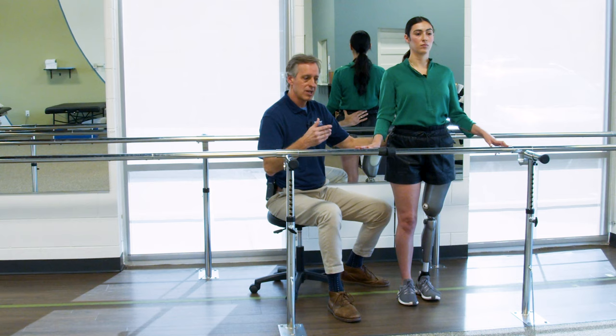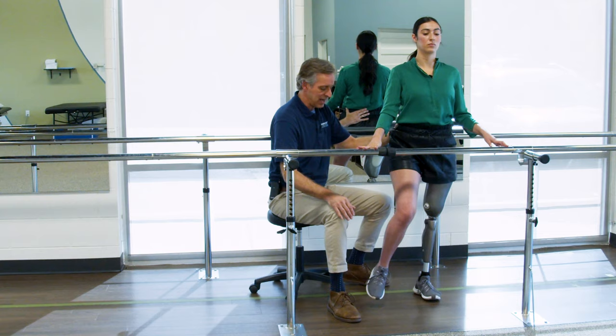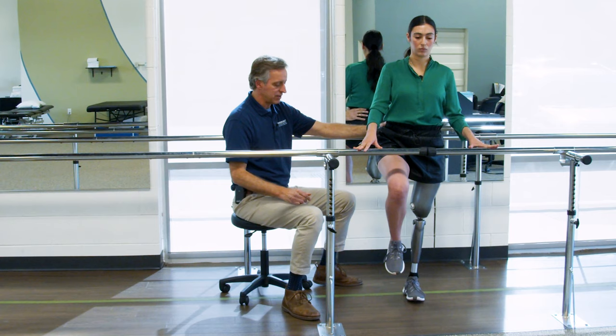So Tracy, with your hands still on the bars, all I want you to do is lift your right knee up, hold it in the air for a second, and then step out to the side. Good. Bring the prosthetic over in the correct position. Good. Lift up, hold that balance for a second, step over.